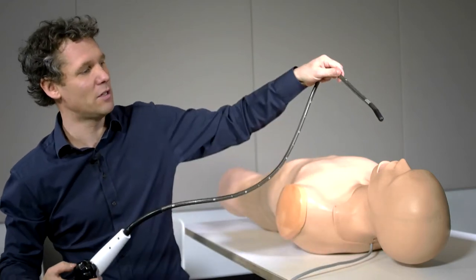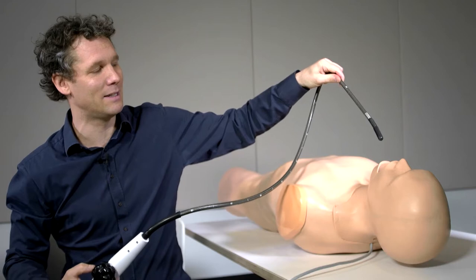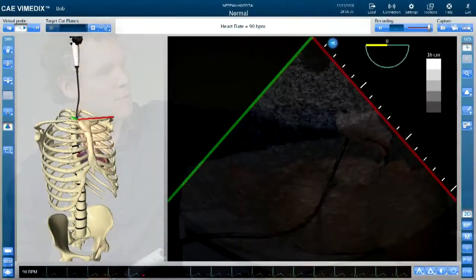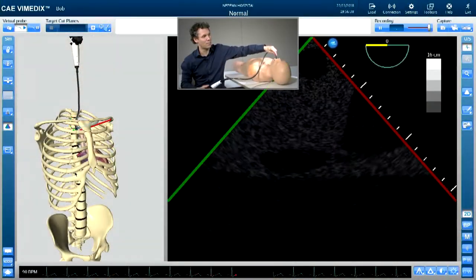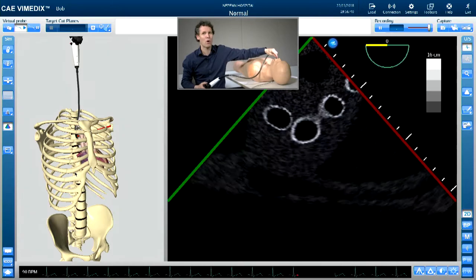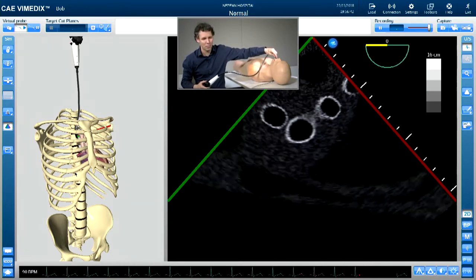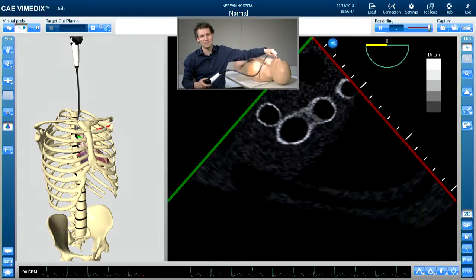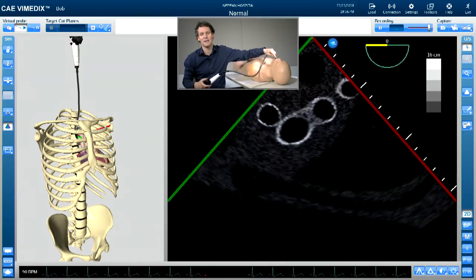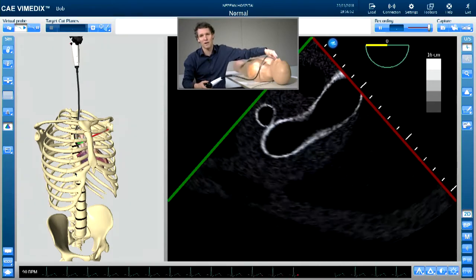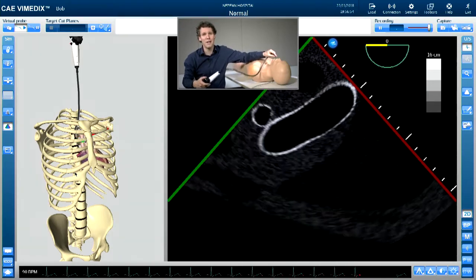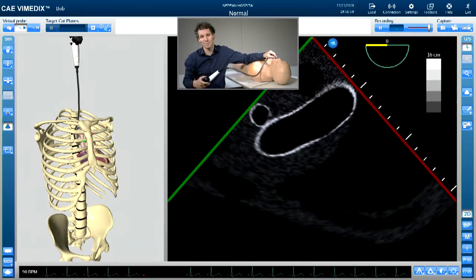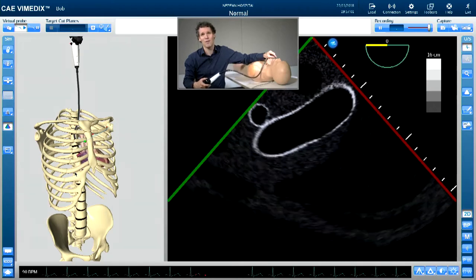I use a bit of retroflexion following the hard palate, then antiflexion to insert it down into the esophagus. I keep gentle pressure on, asking the patient to swallow if they're mildly sedated, which helps direct the probe correctly. You never force the probe. If you're feeling an obstruction, either have another gentle go or ask for help.